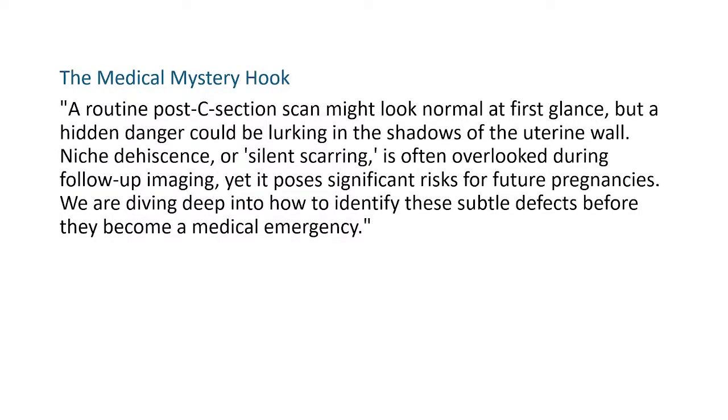So, the medical mystery hook. A routine post-C-section scan might look normal at the first glance, but the hidden danger could be lurking in the shadows of the uterine wall. Niche dehiscence or silent scarring is often overlooked during follow-up imaging, yet it poses significant risk for future pregnancies. We are diving deep into how to identify these subtle defects before they become a medical emergency.